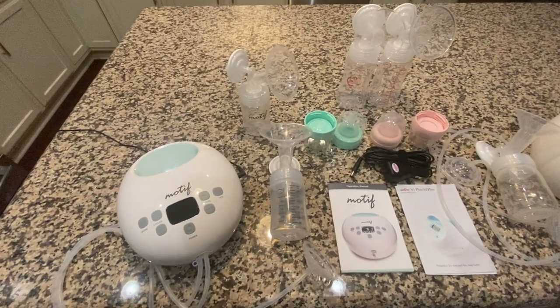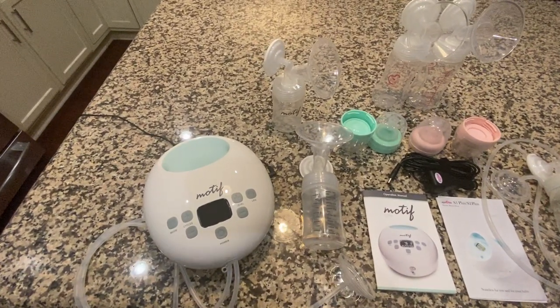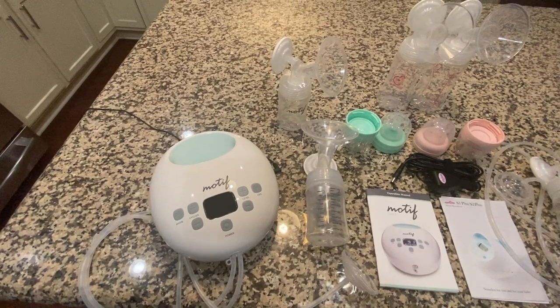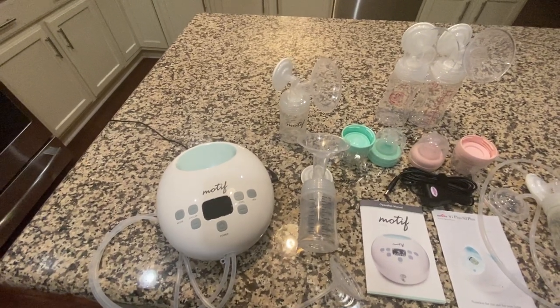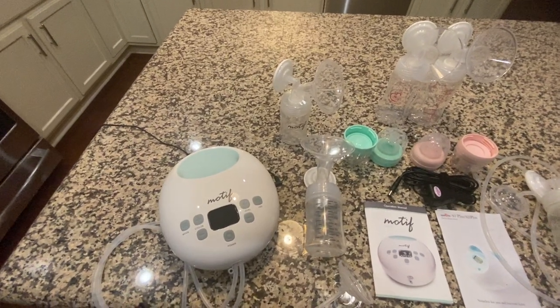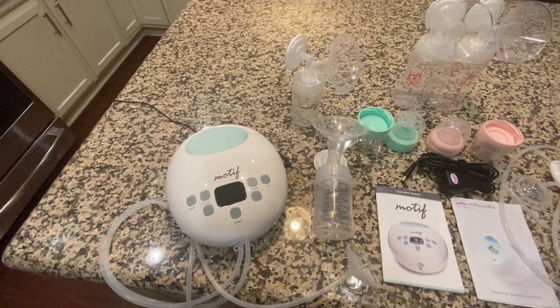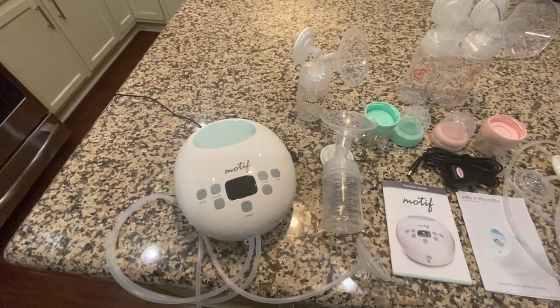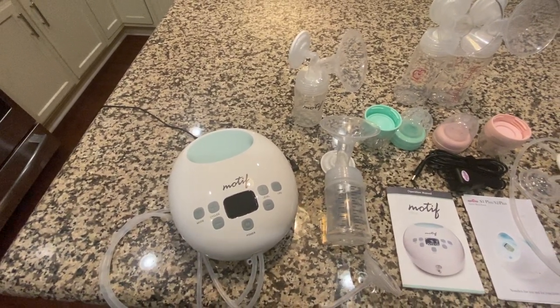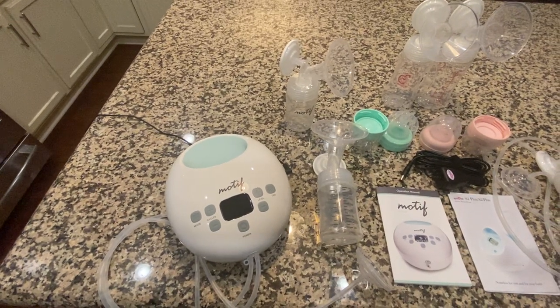Let's start with the Motif Luna. I got this pump about three days ago and I'm thoroughly impressed so far. It was free with my insurance and I got a breast pump bag with it as well. One thing I do not like is that it is not portable — you have to plug it into the wall, which decreases your mobility. That's not going to work for me when I go back to work. This pump is still fairly new; I can't find anything beyond 2019 on it, so maybe they'll offer a portable option in the future.